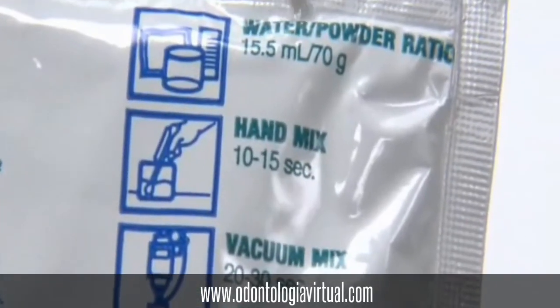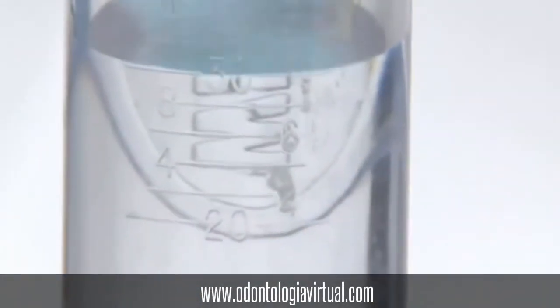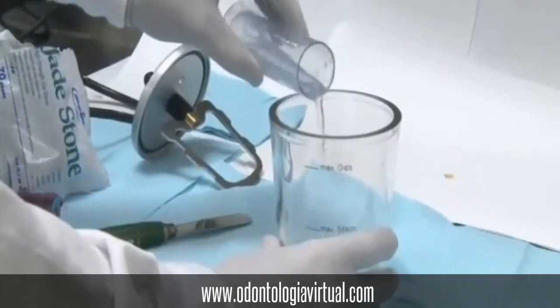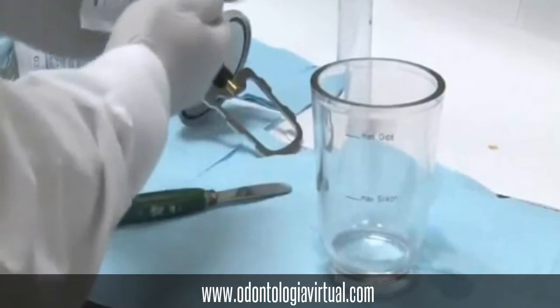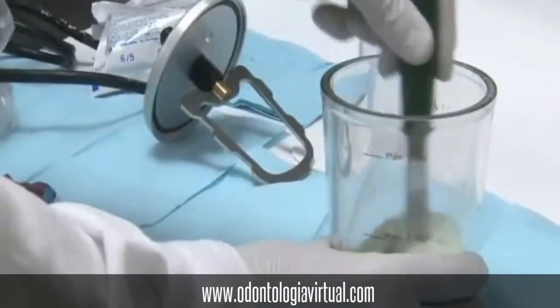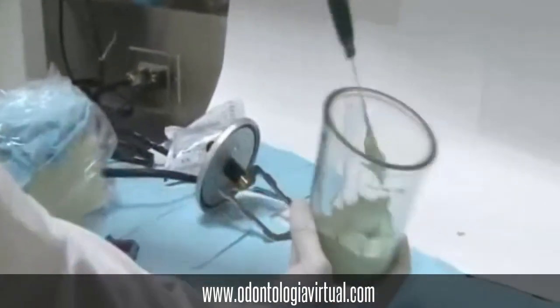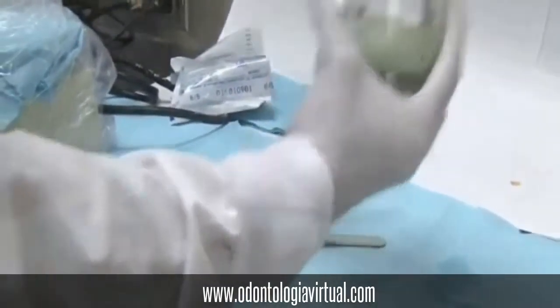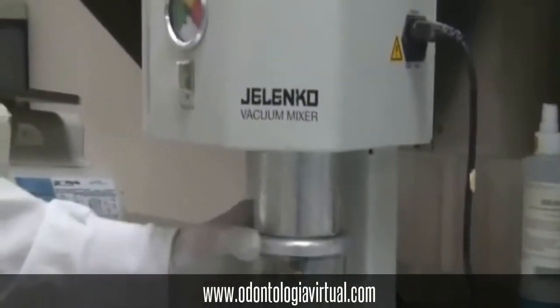We will be using jade stone to pour this impression. We will use 70 gram packets mixed with 15.5 ml of water. We will pour the water in first and then the contents of the two jade stone packets. We will be using the vacuum mixer and vacuum mix that exactly for 20 seconds.